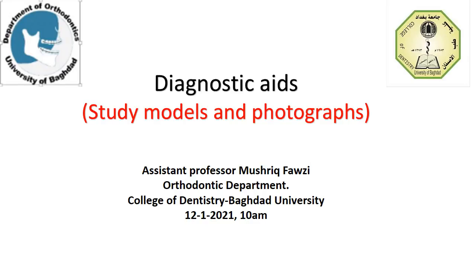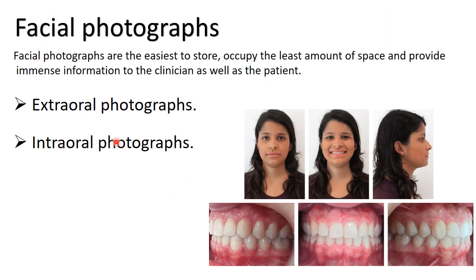The second part of my lecture is the photographs, which is another important diagnostic aid and can be divided into extraoral and intraoral photographs. The other diagnostic record is the facial photographs. Facial photographs are the easiest to store and occupy the least amount of space, and provide immense information to the clinician as well as the patients.